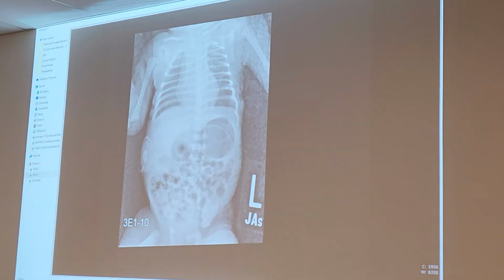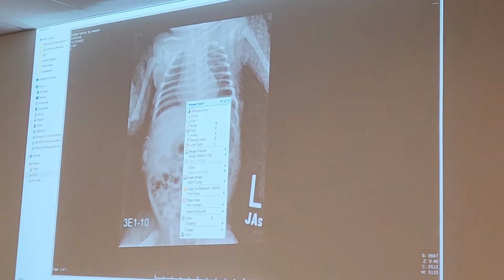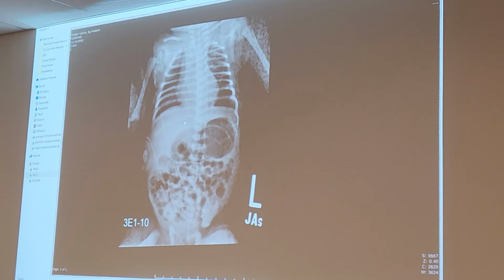Over here in the chest, I've got black and I've got white, these big jumps in color. So here I have high subject contrast. Over here, I've got liver, I've got muscles. Here I have many more colors. My jumps aren't as big.